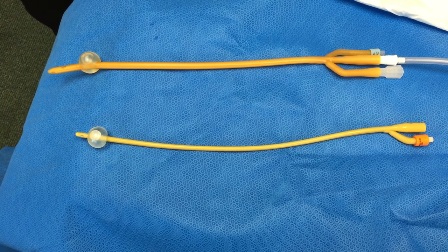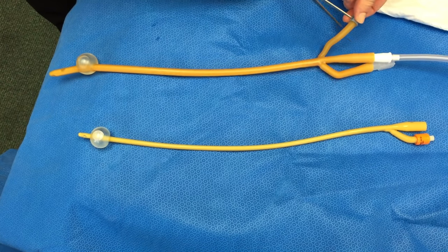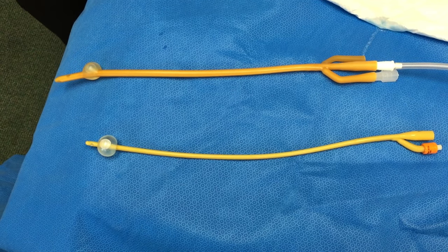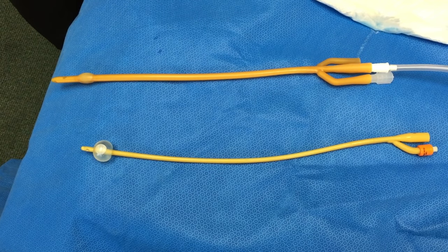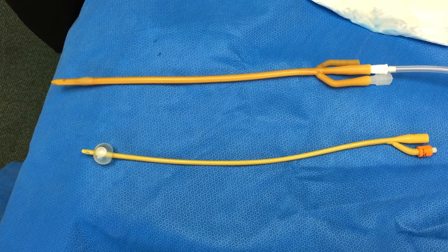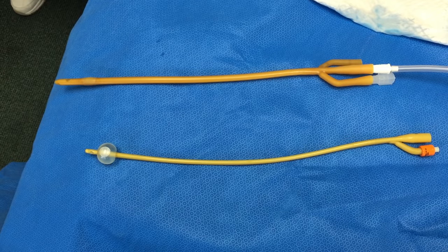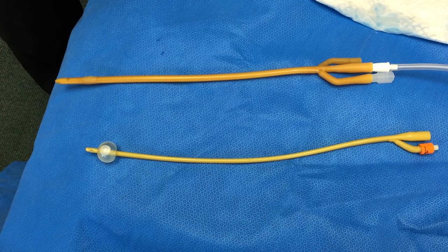What you want to do is identify this balloon port and simply cut the tubing that connects the port to the catheter. You'll notice that when this tubing is cut, water comes leaking out. Also notice that the balloon is deflating. Don't worry if this fluid gets on you — it's just sterile water. Now that the balloon has been deflated, you should be able to pull the catheter out with very minimal resistance.